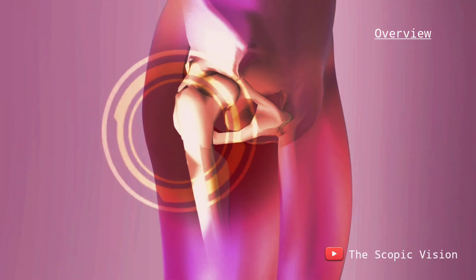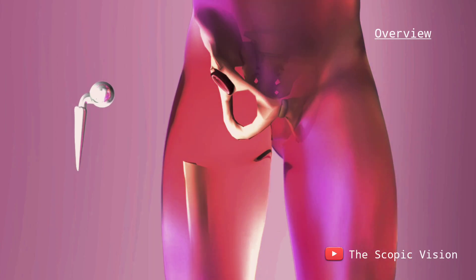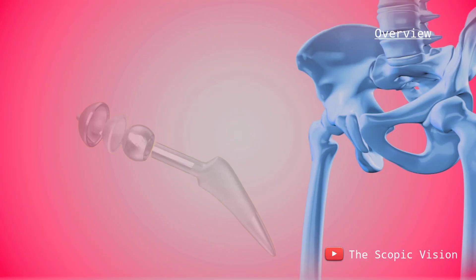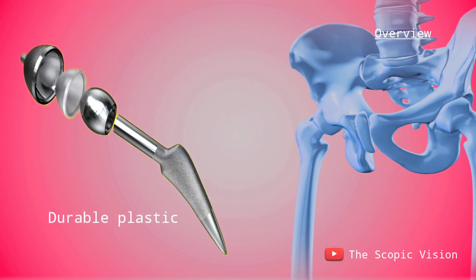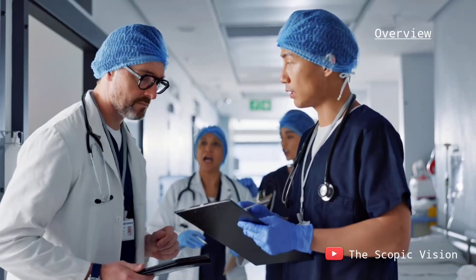Hip replacement surgery, or hip arthroplasty, is a medical procedure that involves removing the damaged parts of the hip joint and replacing them with artificial components made from materials like metal, ceramic, or durable plastic. Let's explore the reasons for this surgery and how it is performed.